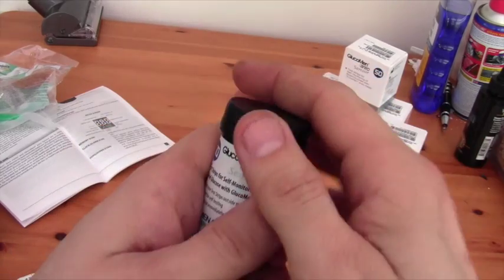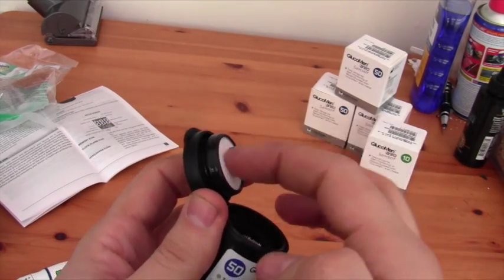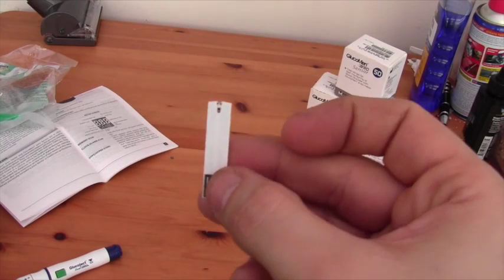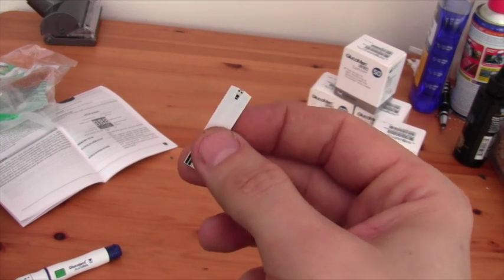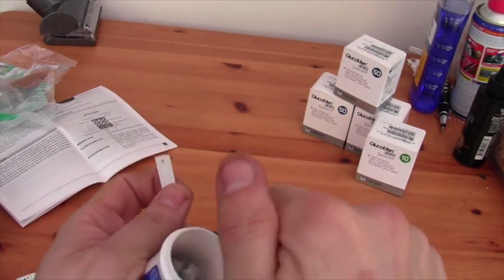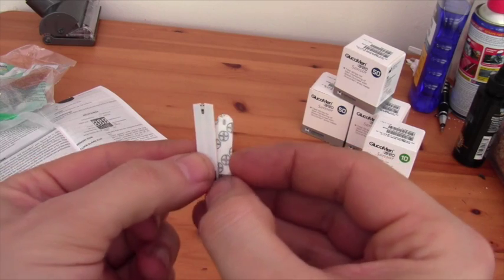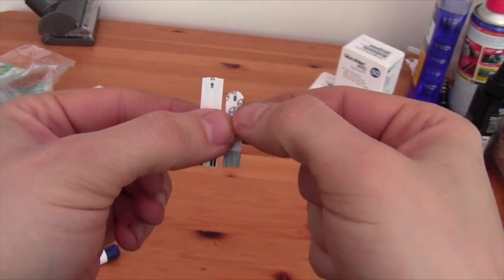We take a test strip. What I quite like about these pots is there's obviously some sort of silica gel in the top to keep your strips dry. They are quite a chunky strip. Let's take a comparison — there's a Contour Next test strip which is a fair bit shorter and narrower.